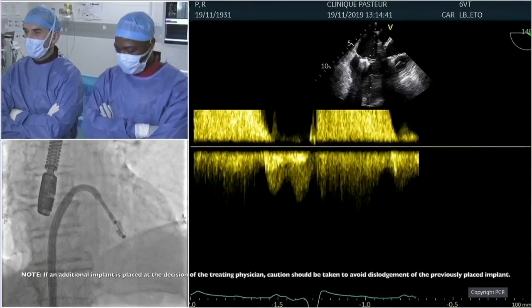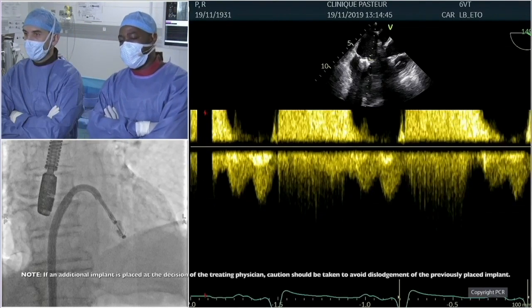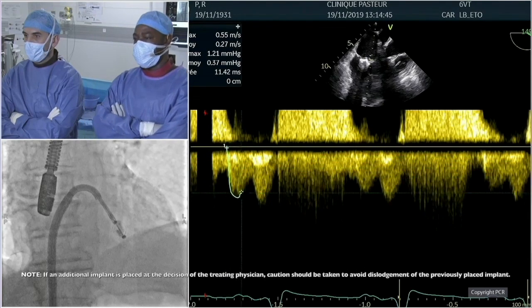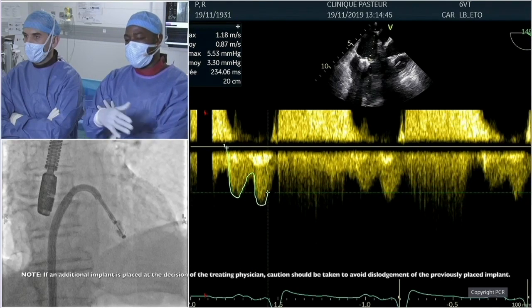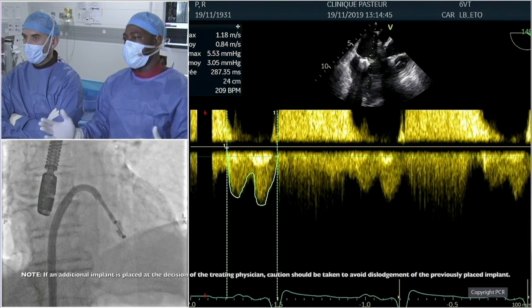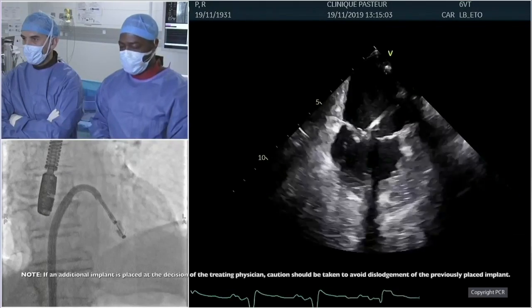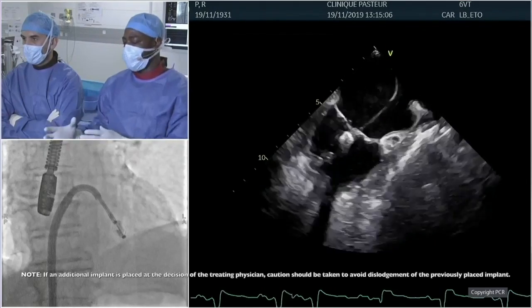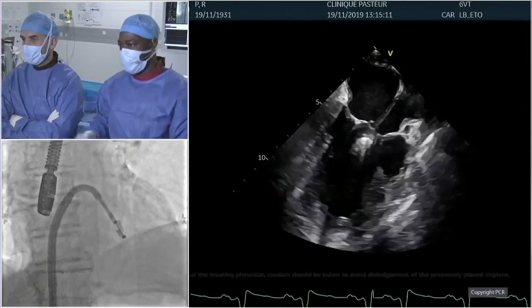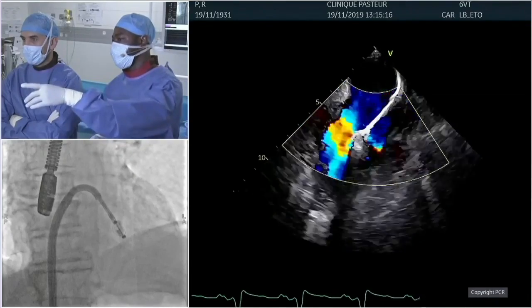Regarding the second device, Cece, what do we think is the gradient after the second device? To which extent will we increase it? In our experience, it doesn't change that much. If you are at 4, you're going to remain at 4 or maybe 5. The spacer really prevents extreme tensioning on the leaflet, so the gradient tends to be stable, between 1 and 2, with the Pascal device. And so we're not worried. If we think that the patient is going to benefit more from a second Pascal, we do it. If the gradient is about 4 or 5, it's not going to change. So here there is still a lateral jet.